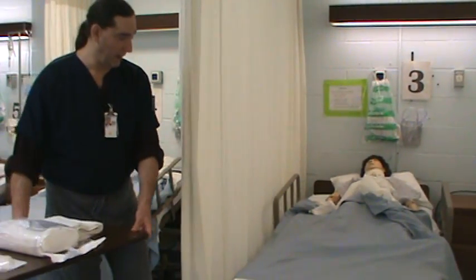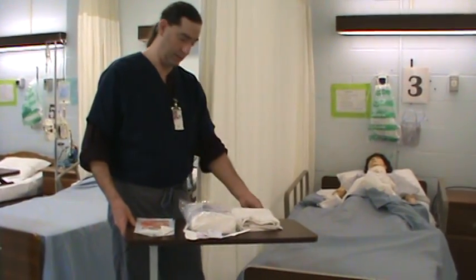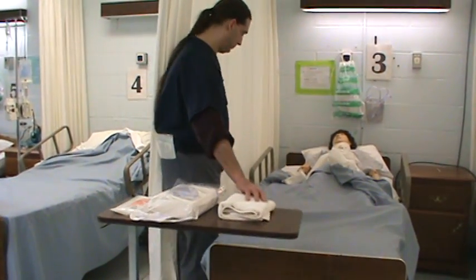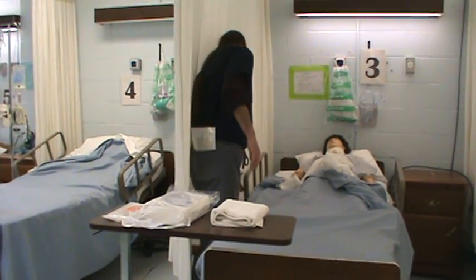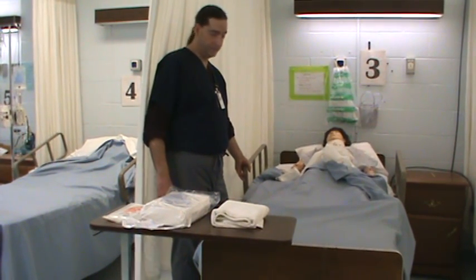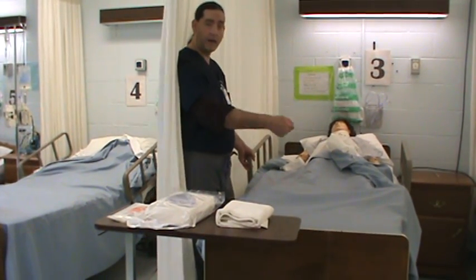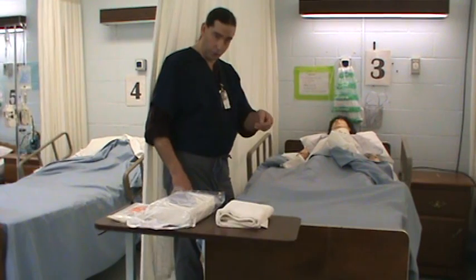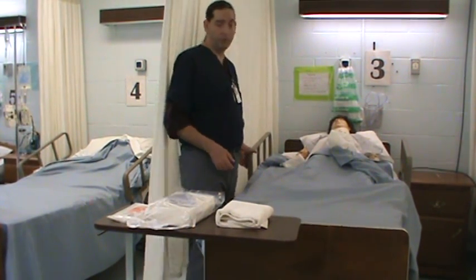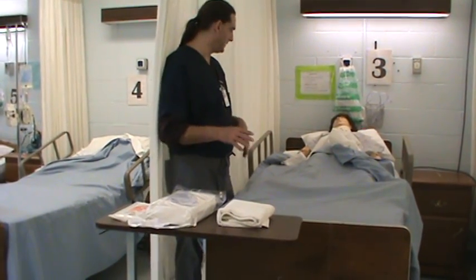I'm going to get my equipment and raise the bed up to an adequate working height. I'm left-handed. If you're left-handed and you're new at this, you want to be on the left side because you want to be controlling the catheter with your dominant hand. I've done this for 20 years, so I can do this with either hand. With practice, you get to be ambidextrous.